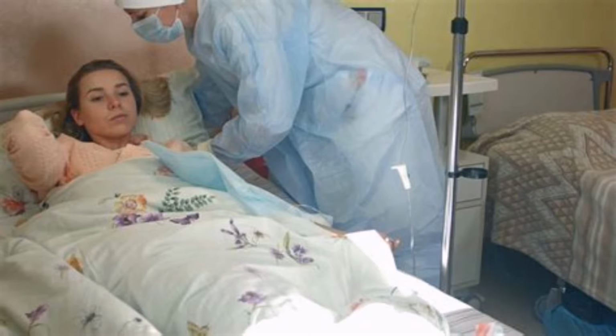Have the client in a supine or low Fowler's position in bed. The supine position permits either arm to be used and allows for good body alignment. The low Fowler's position is usually the most comfortable for clients.